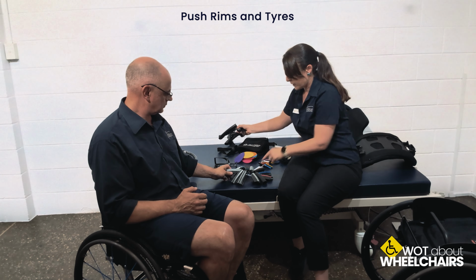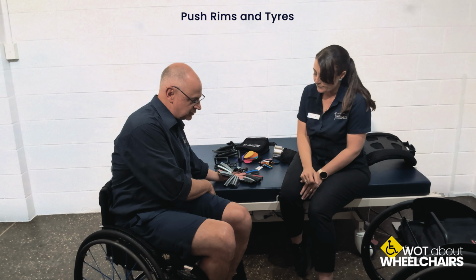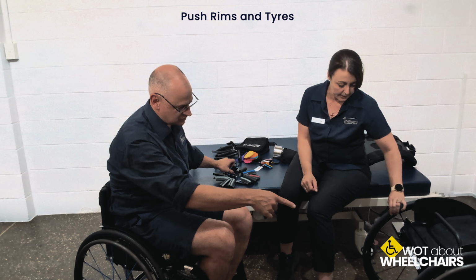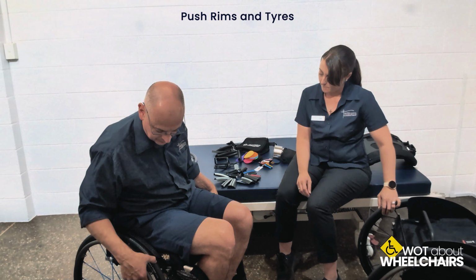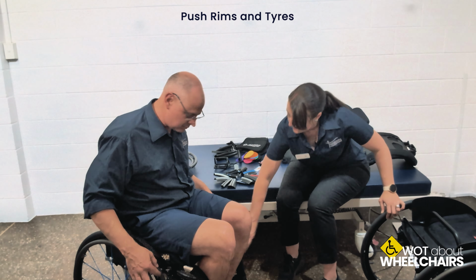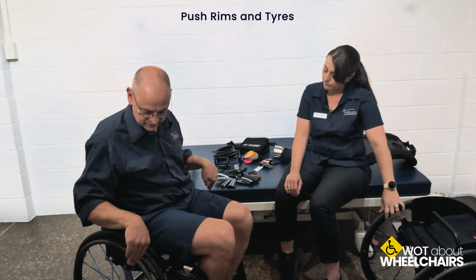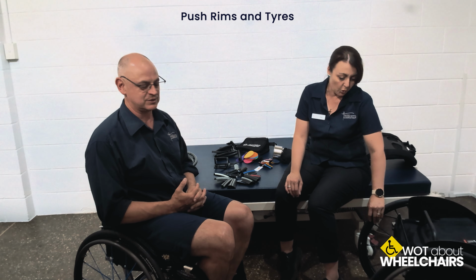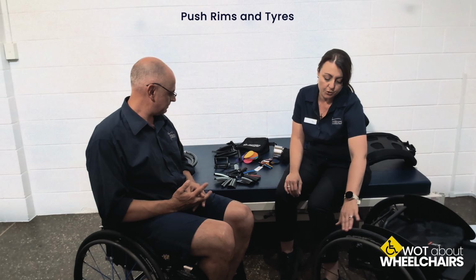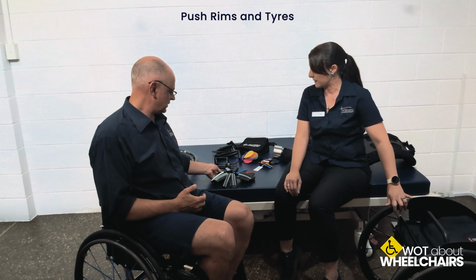The other thing, we're going to talk about tyres. I can just see the difference between this wheelchair and that wheelchair just on the tyre itself. This one is more like what you'd see on a racing bike. Not much tread right in the middle, but lots of water dispersion on the edges to make sure I get a bit of grip if I'm going through wet. Now that one there has got a different design altogether. It's more like a slick tyre that you see in a racing car. You use that on flat surfaces, not so great if you're going over uneven pavements and things like that.